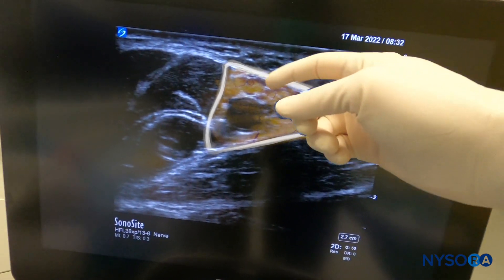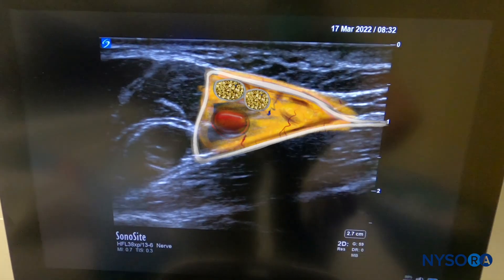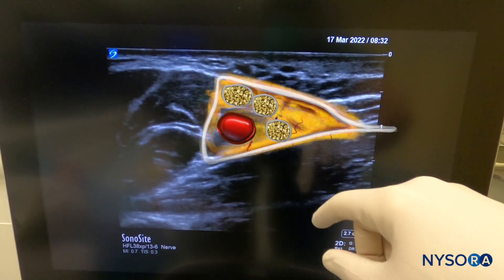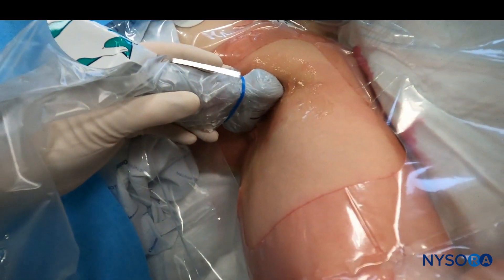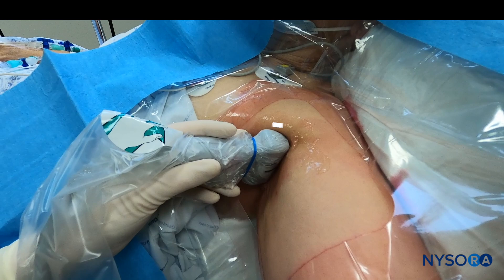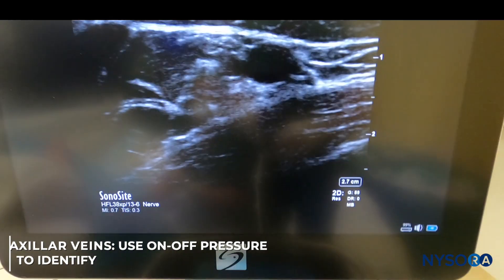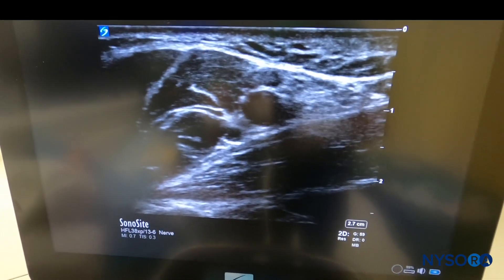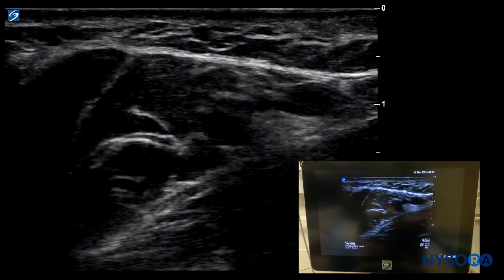That's the axillary brachial plexus sheath. Up here we can see the median nerve, that's the ulnar nerve, and that's the radial nerve over here underneath the big axillary artery. Releasing and applying pressure on the transducer — more pressure, less pressure — closes and opens the veins. This is a very important maneuver for safety to assure that we recognize all the necessary vessels in the axillary brachial plexus sheath.